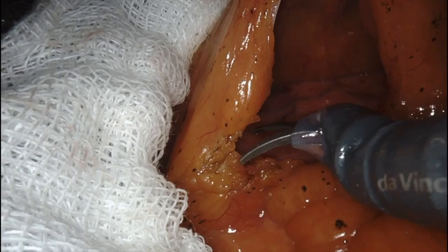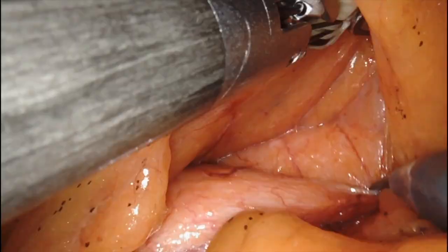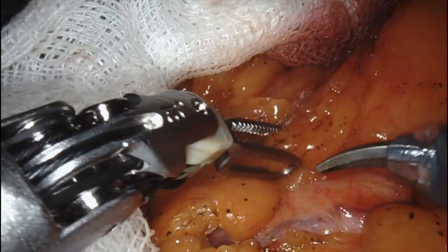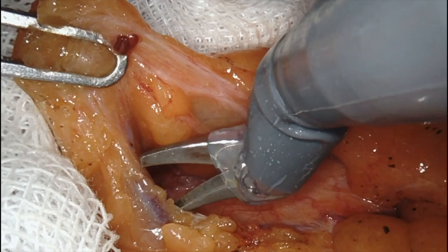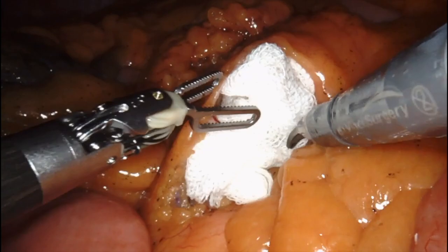Here you see me dissecting the plane between Gerota's fascia and the mesocolon on the transverse colon. I worked my way up almost as lateral as Toldt's fascia, and when I felt I was close to the pancreas, I stopped my dissection and turned my attention to the vascular pedicle.